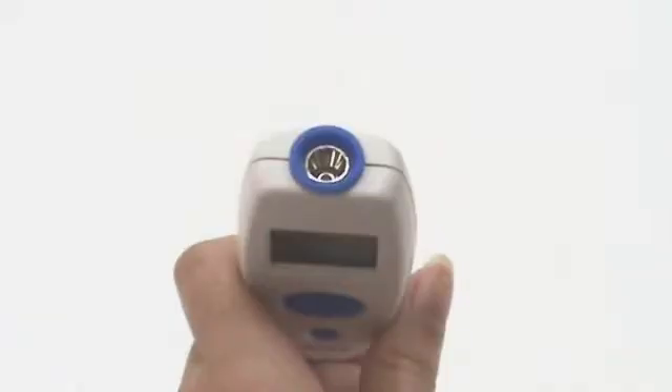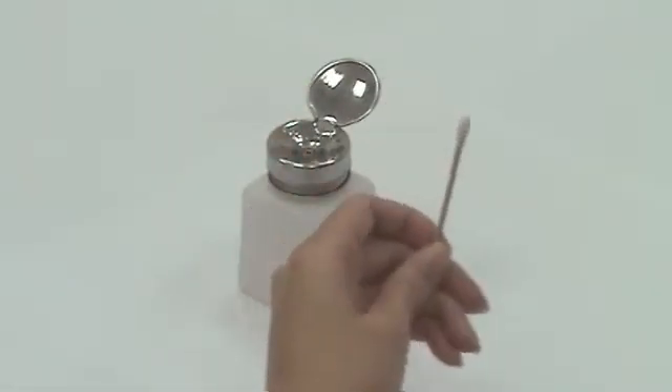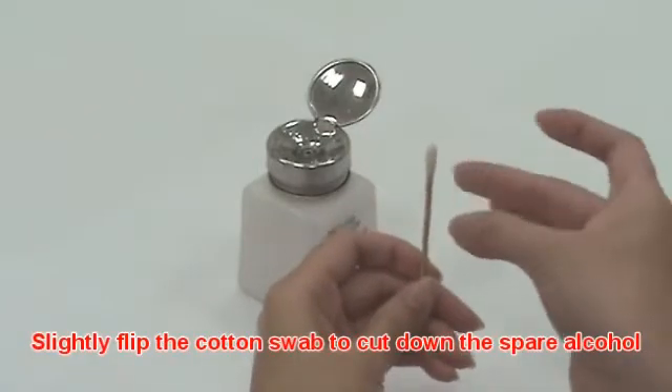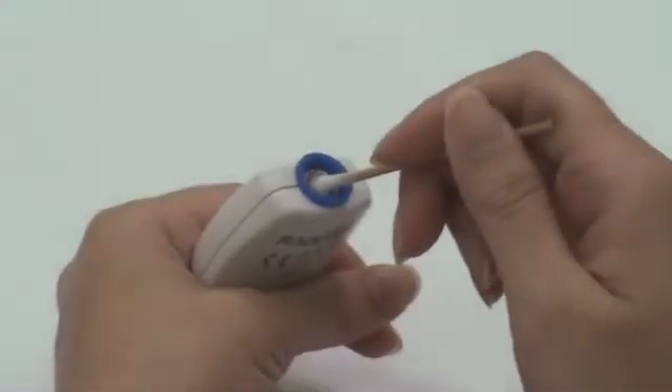To ensure accurate measurement and avoid cross-contamination, clean the probe after each use. Please use a cotton swab with 70% concentration alcohol to clean the probe. Slightly flip the cotton swab to remove any excess alcohol.